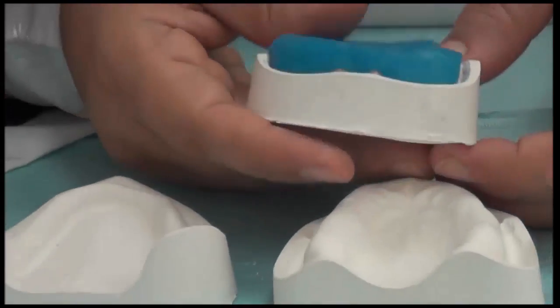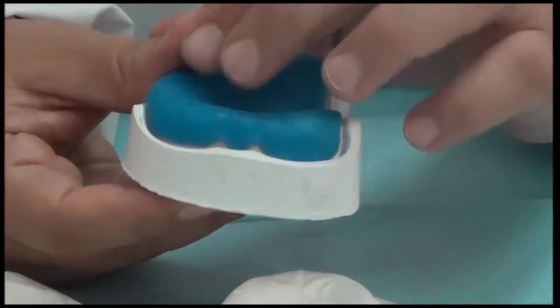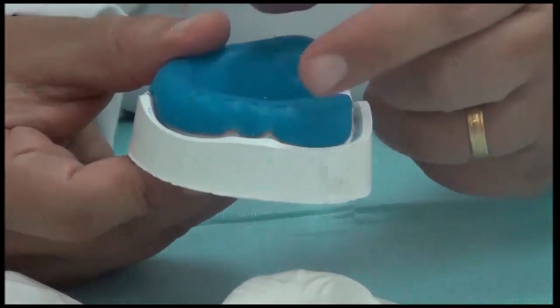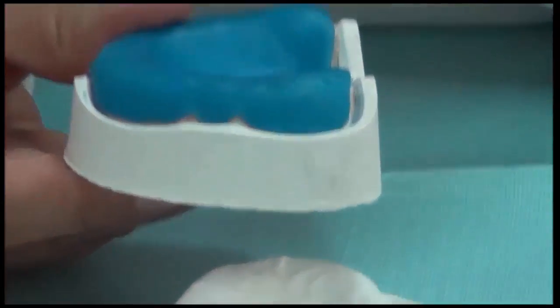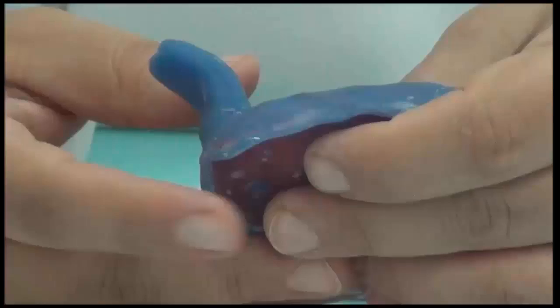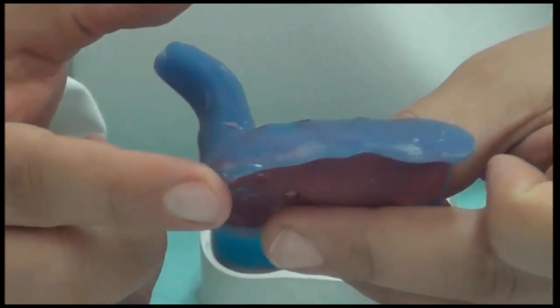To perfect border molding, which is adding green stick to these borders, we need to make sure that we have space for the border molding material. How do we create space? By making our tray short from the sulcus. The tray is not in the full depth of the sulcus. The tray is short from the sulcus by around 2 to 3 millimeters. This allows a space for the green stick to be placed inside the mouth later on. So the outline of the tray will be away from the sulcus, and the border all around will be short from the sulcus by 2 millimeters.